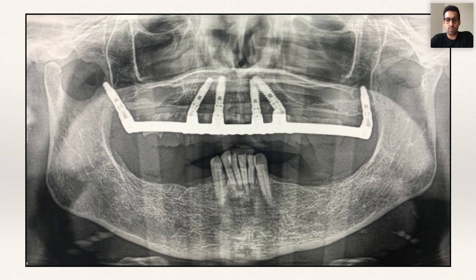What I would add is that something you do need to be wary of when you do the prosthetics for patients that have pterygoid implants, i.e. large AP spreads, is that the prosthetics is certainly more challenging, because you really need to be careful achieving the most accurate passivity as possible on your metal framework, and that can potentially be a challenge when you have such a large AP span. So there are certainly prosthetic challenges when it comes to construction of your prosthesis when you place pterygoid implants. So please just be aware of that.